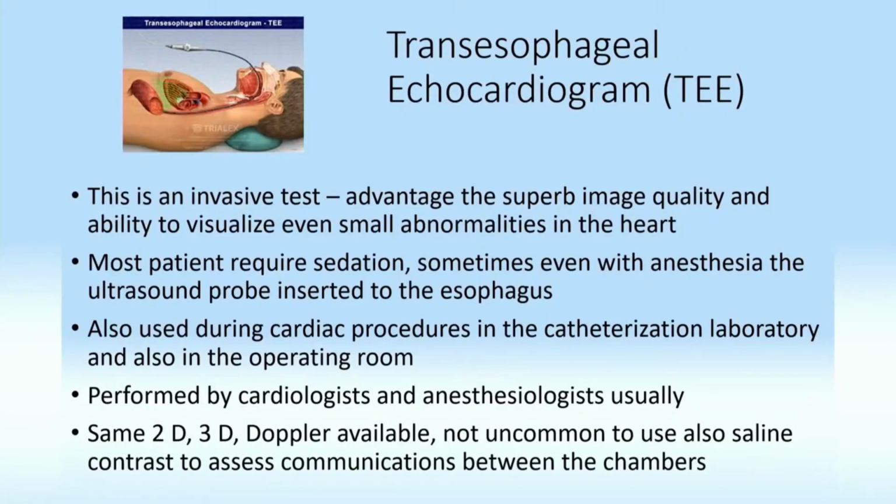Then there is the transesophageal echocardiogram, which is an invasive test. And on the side there, you can see how the probe is going inside of the body. Most of the people, before they have any kind of valvular surgery, will have a transesophageal echocardiogram. And this is an invasive test because it goes inside of your body. The advantage is incredibly great images. It's just very well visualized. Everything is like holding the heart in your hand. And even very small abnormalities of a couple of millimeters, we can actually distinguish.